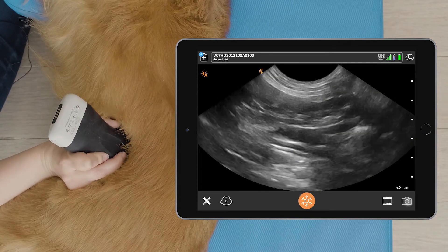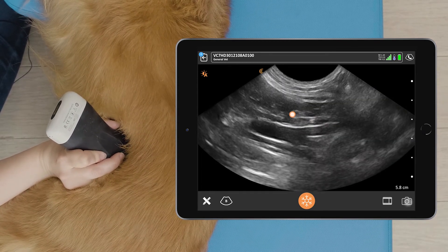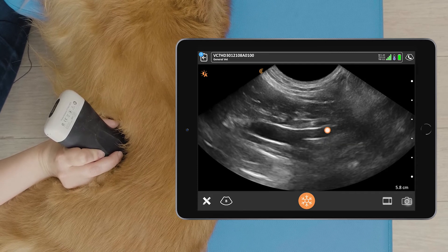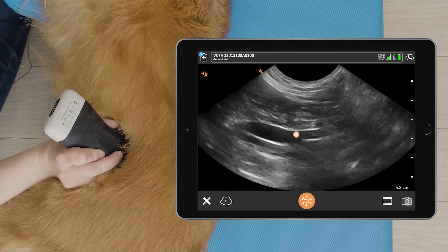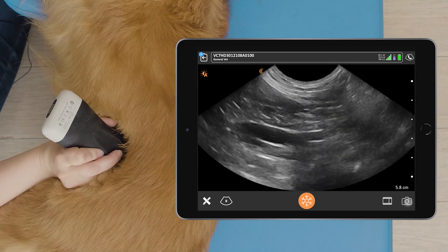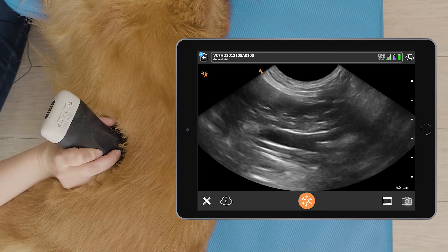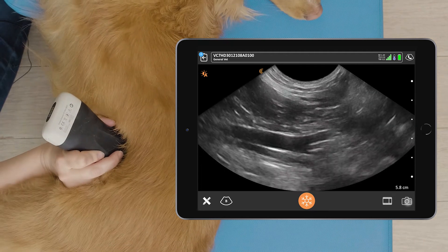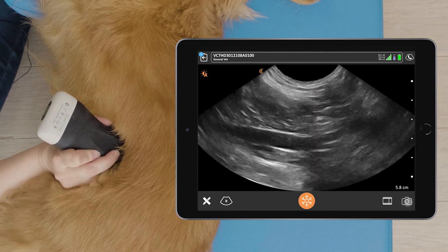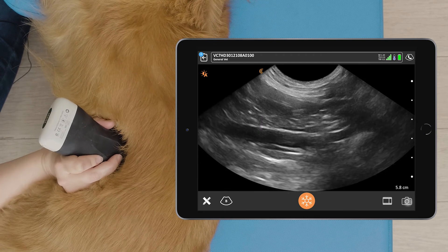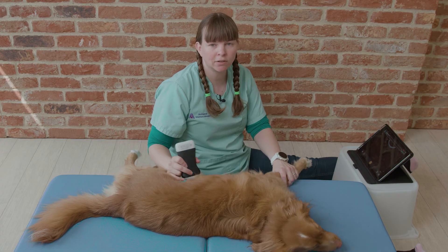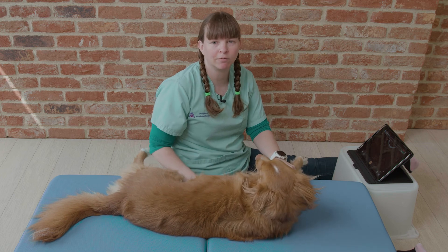The left medial iliac lymph node lies up against the external iliac artery at the aortic trifurcation. It's slightly hypoechoic compared to the surrounding tissue, but can be very difficult to see when it's normal. It is more obvious when it's pathological. And that's how to find the left medial iliac lymph node.